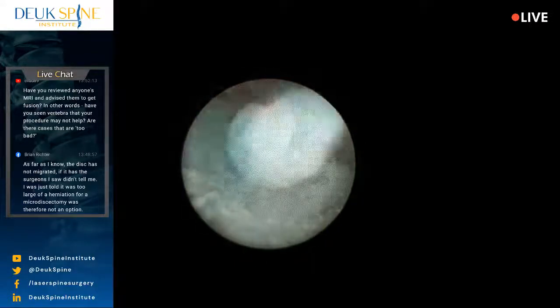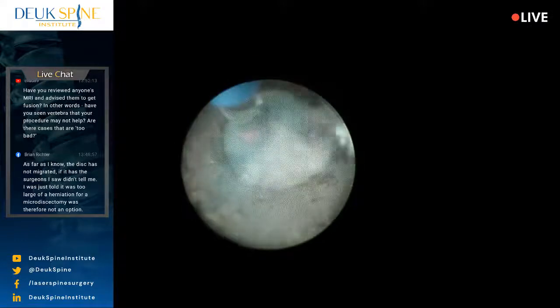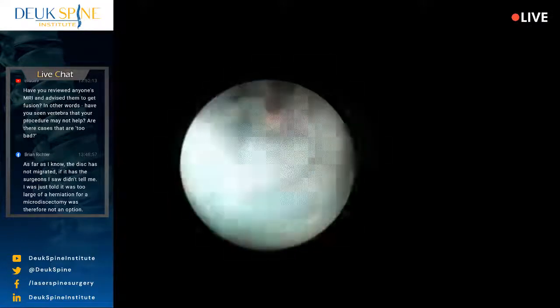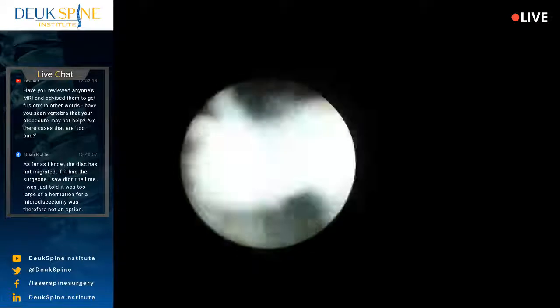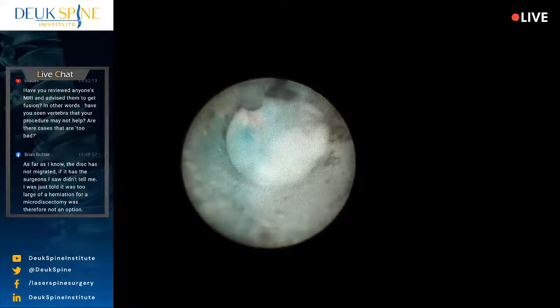Yeah, sure. All right. There's a tear, by the way, that blue line. That blue line is the tear. The white thing is the annular tear, the annulus that's torn. The blue stuff is the herniation stuck in the tear, called the interposed herniation. But go ahead.